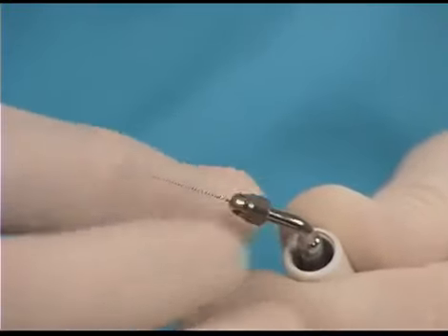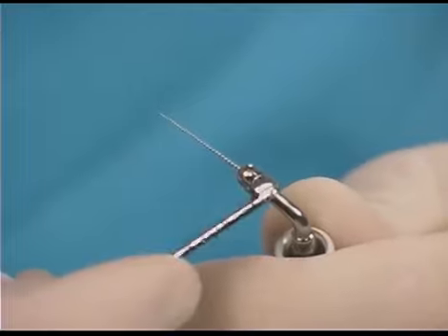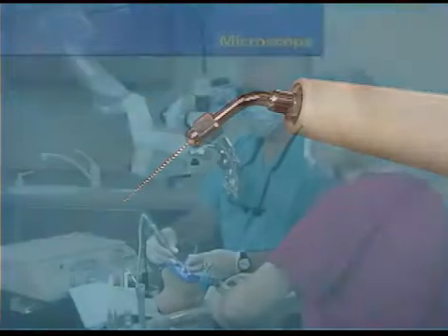Although tedious, small stainless steel hand files can be pre-curved, inserted into available space, and used at low power in an ultrasonic effort to remove a broken instrument. This technique is at times useful when the root is thin and/or the canal is curved.